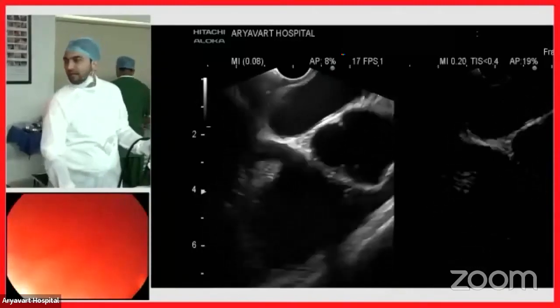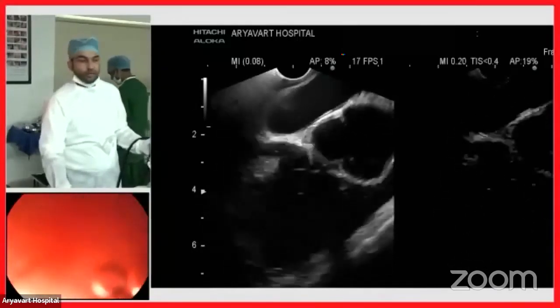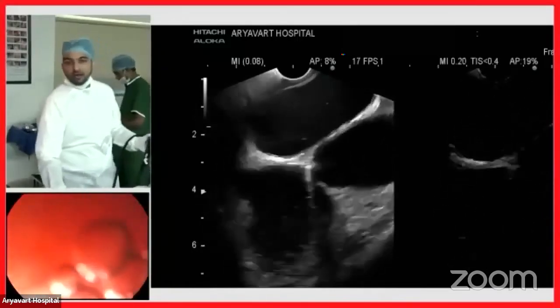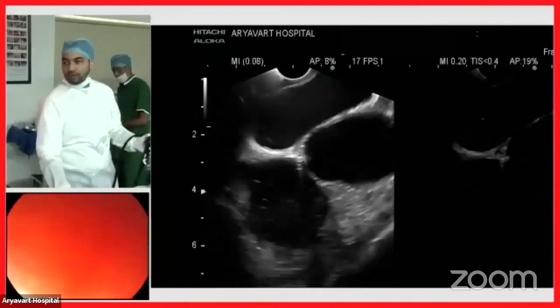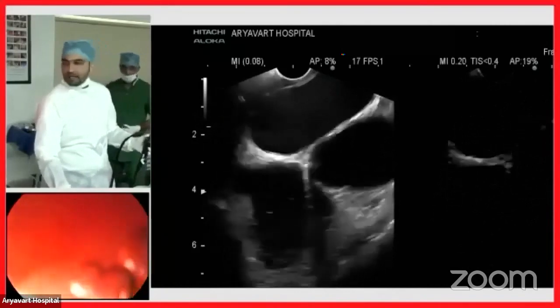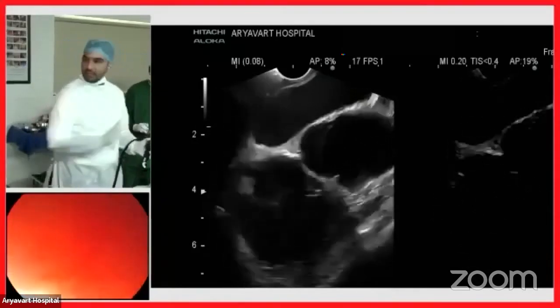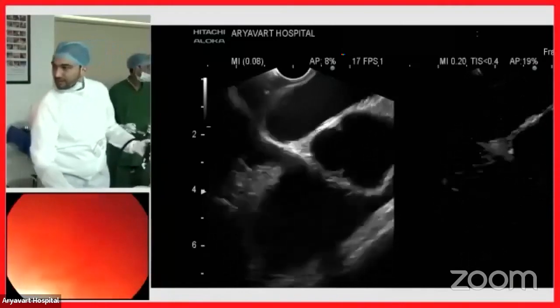We do not need a further push by another 10 ml of saline, which we usually do for contrast injections. However, for this purpose, I think just the agitated saline is enough. Excellent. We'll let the bubbles clear out.